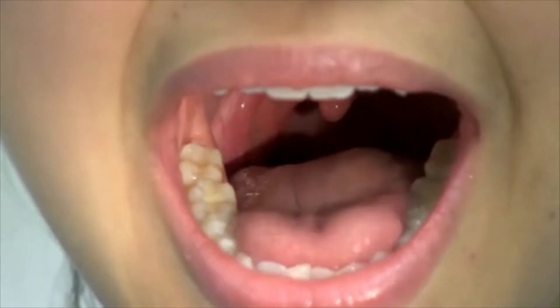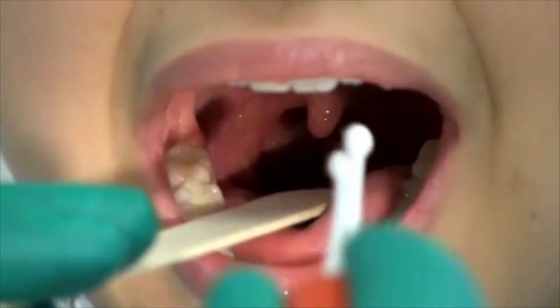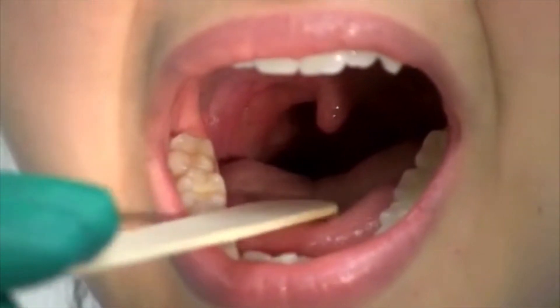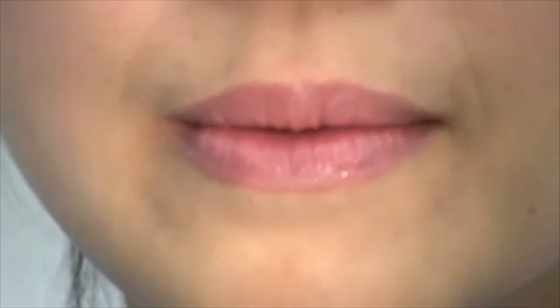Insert the sterile cotton swab into the mouth and gently rub it on the tonsils. Proceed swiftly as the patient will likely gag. After collecting your sample, place the cotton swabs in the culture medium.